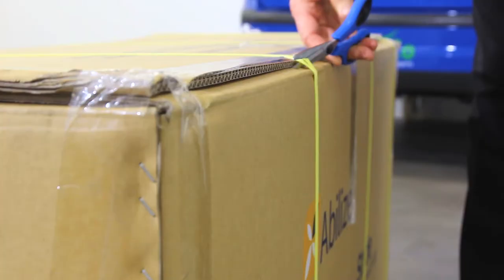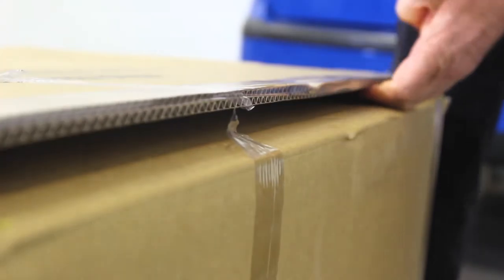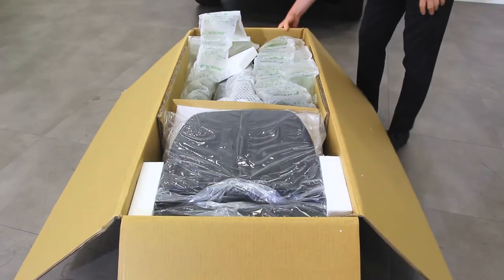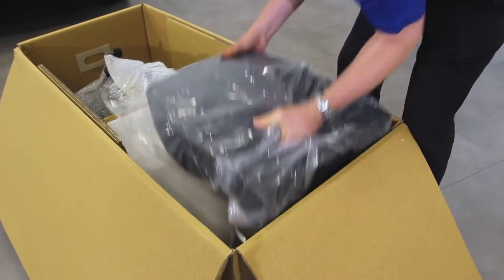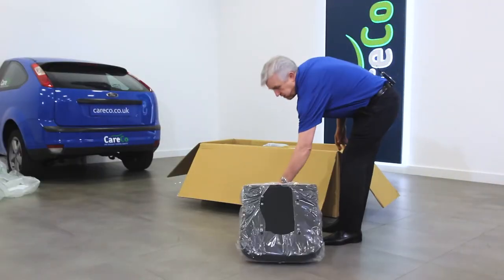To open the box, carefully cut the tape and any straps with a knife or a pair of scissors. We will now show you how to safely remove your scooter from the box. First, remove any excess packaging then start lifting out the various scooter components, starting with the seat, headrest and colour shrouding.